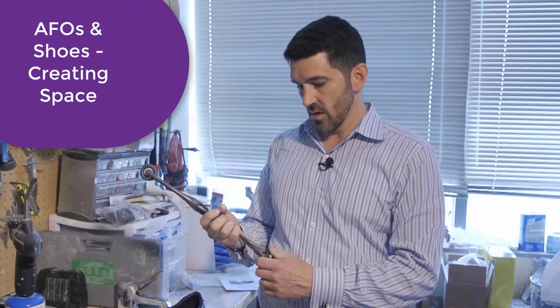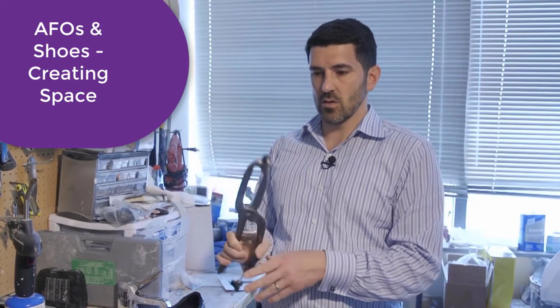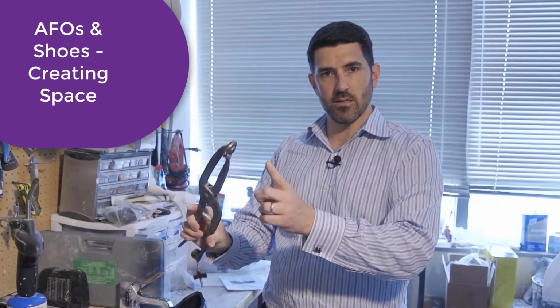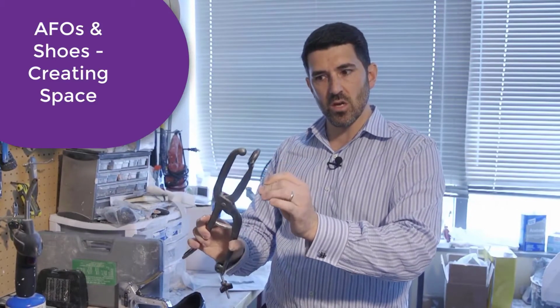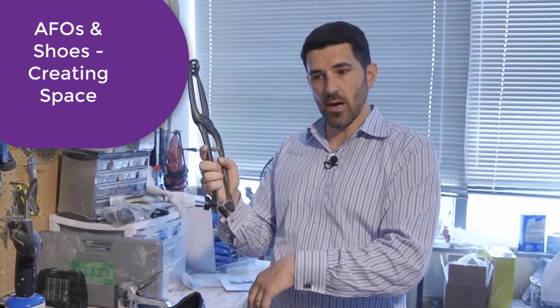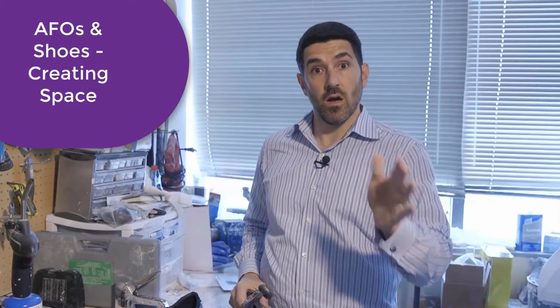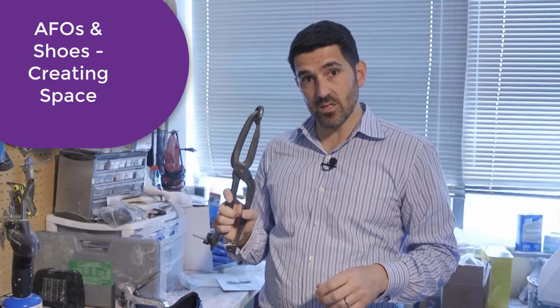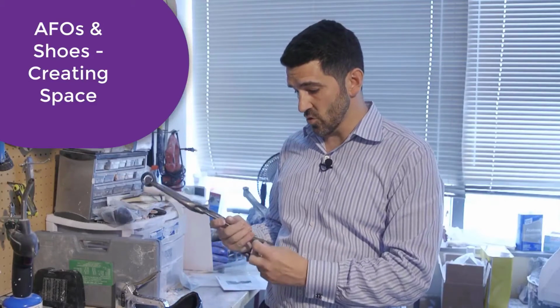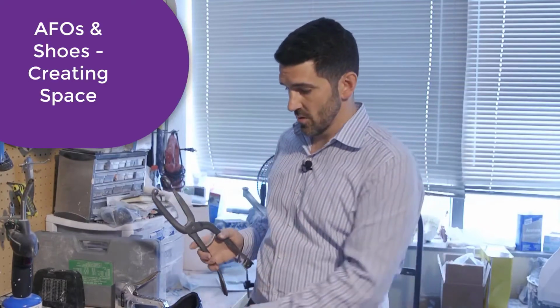This is a shoe stretcher that we use, and you can already kind of imagine the process here. We're pushing out on the leather, on the material, whatever it is, via this action. And then you can tighten it up more by tightening the bottom. So if you give an orthotist a day, they can definitely knock out a few spots for you. If you want a whole area stretched, this thing just needs time. It just doesn't happen that quickly. But it can stretch out a shoe for you. So this is what an orthotist would do to help you with your AFO and your shoe tightness issue.